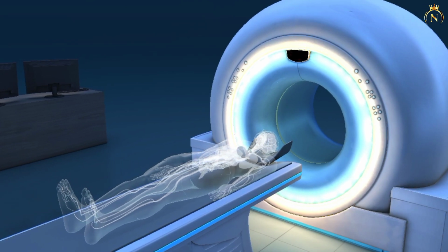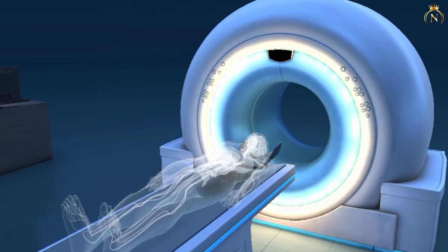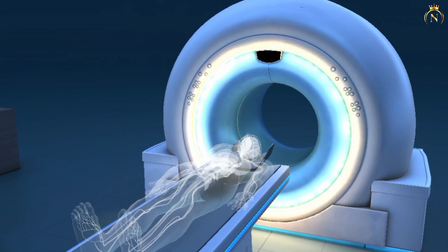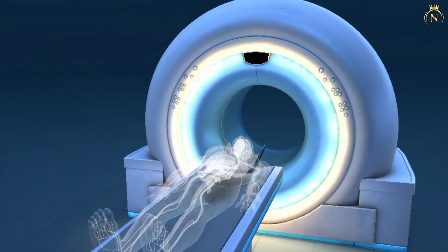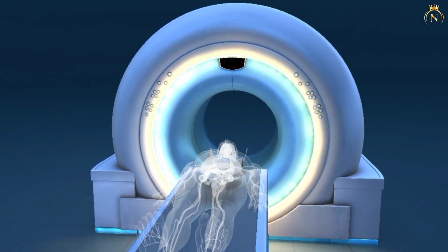PET is usually accompanied by another diagnostic technique called computed tomography, or CT. The images obtained with PET-CT can reveal more anatomical detail, thus increasing the accuracy of the diagnosis.